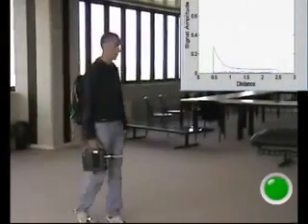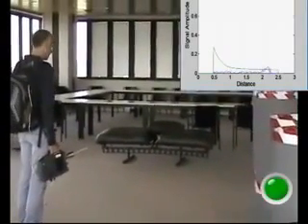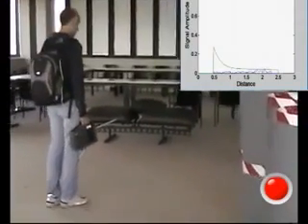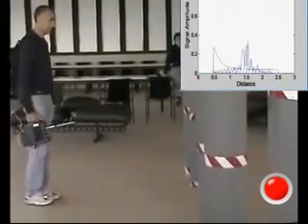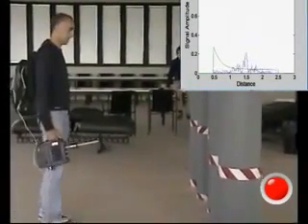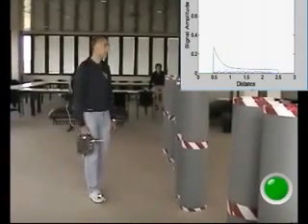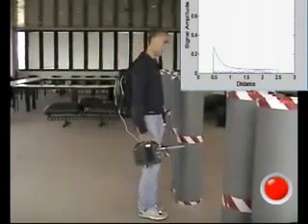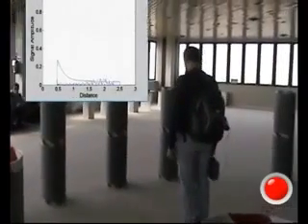A second demonstration was carried out to test whether it was possible to locate an opening, like a door, in a wall. Also in this case, the subject successfully achieved the aim. A different version, with a higher degree of difficulty than the previous one, is represented by a curved wall. However, even in this particular situation, the subject was able to locate the exit.